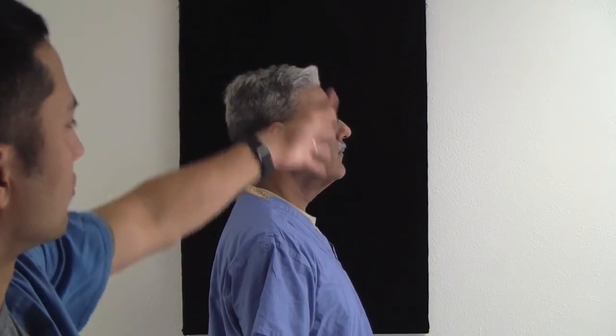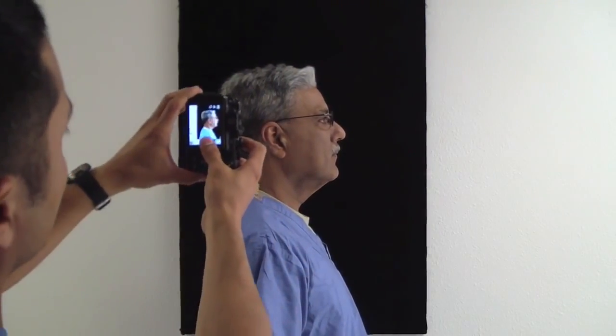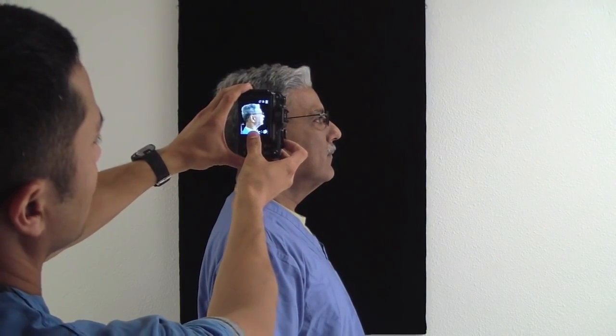So to get a profile photo, which we do use during our presentations and also for our orthodontic part of our residency, we get the patient to imagine they're facing a mirror, and for some reason that gets them to stand perpendicular to us. So just move a little bit forward. One of the things is to keep them within the black region if you're using a black screen, because as you take a photo and you clip it, it becomes even more difficult.